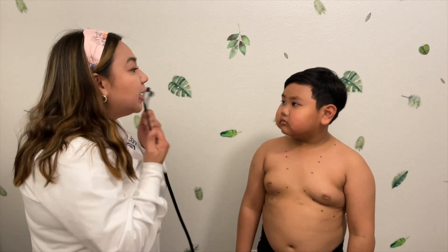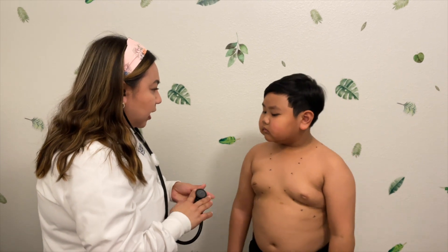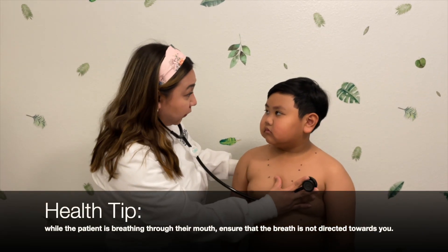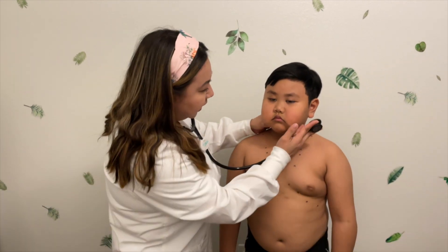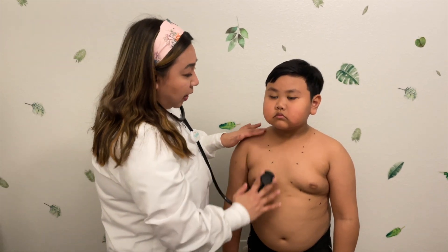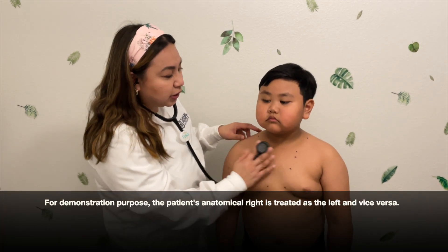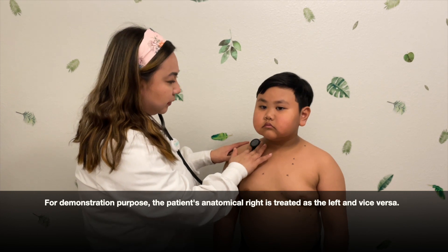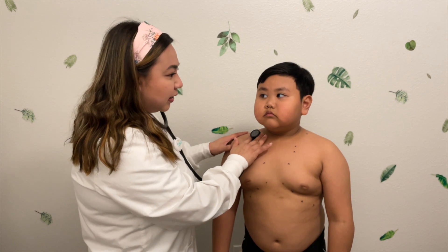When you feel the stethoscope on your chest, just take a deep breath for me. Let me know if you're feeling dizzy — just do it as naturally as possible. When I'm doing this, I'm going to start from top to bottom and also moving from the left side to the right side.